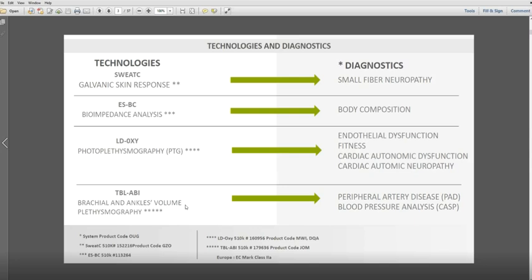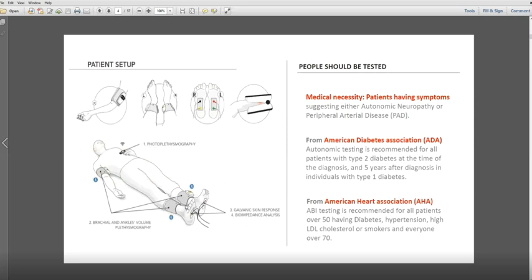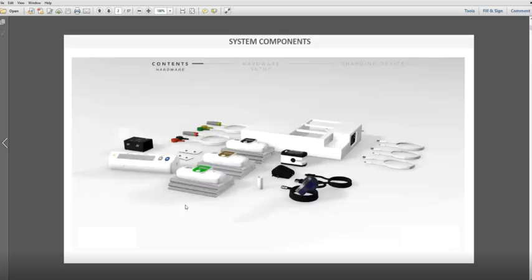We perform significant analysis of the blood pressure for hypertension, central systolic blood pressure. We'll get to the markers. We'll get to the software. So you'll see how all of this plays out as I continue through the background of what the medical device is. So you've seen the medical device, the hardware pieces, okay?